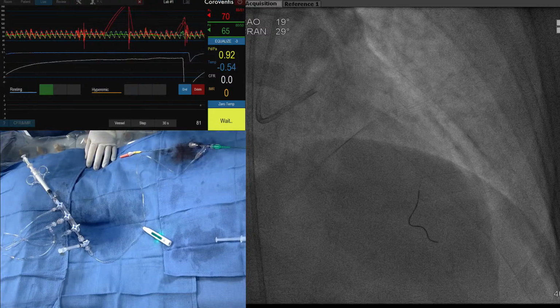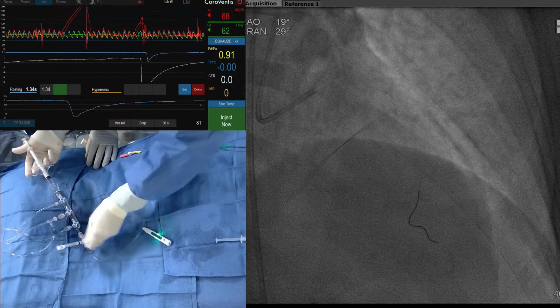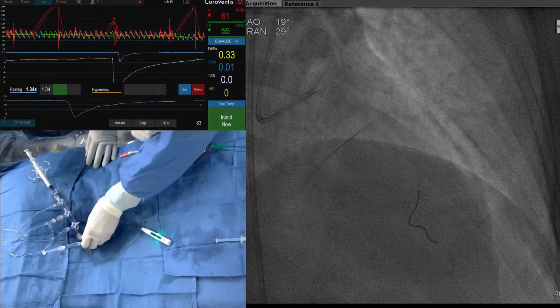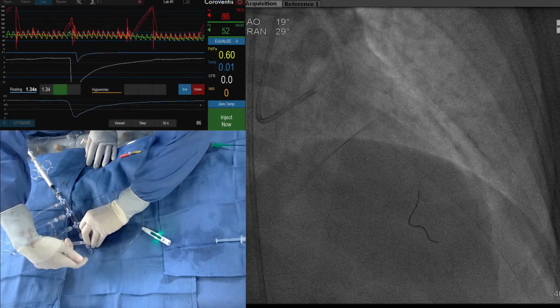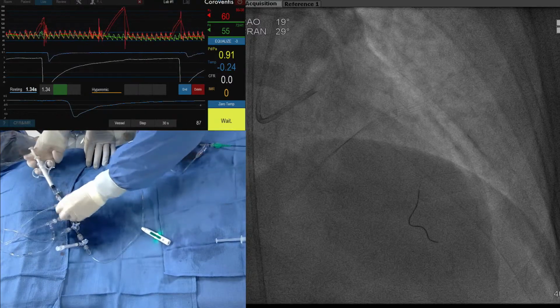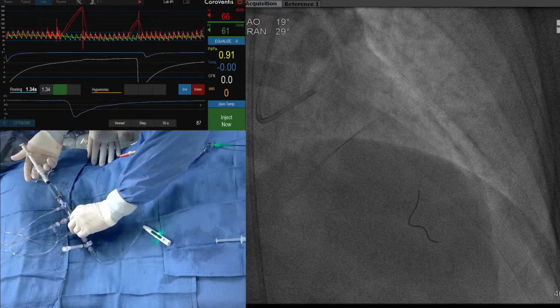So there's our first test. Very key is the position of the guide. Yep. If the guide is out, your testing is not going to be good, so be sure your guide is properly engaged. So I wait till the temperature gets back down to 0. You see our first curve there, 1.34 seconds. I repeat it. This is important. So 1.34 seconds, you're going to see after adenosine how that changed.